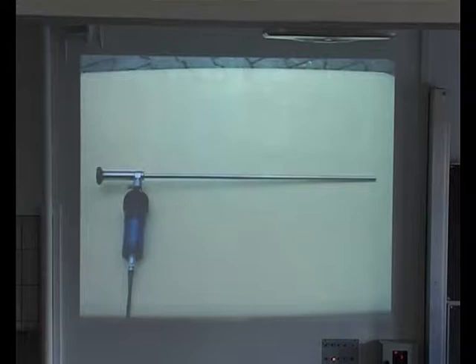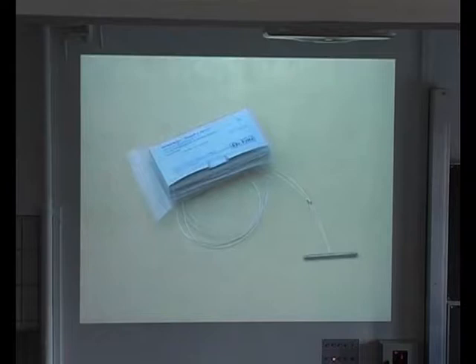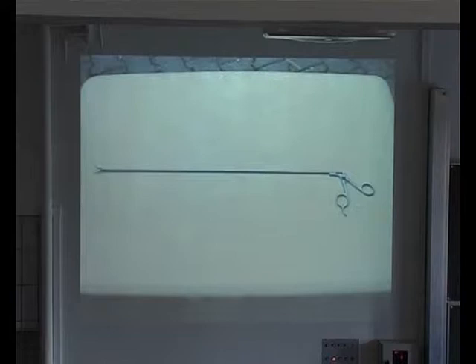We have the toggle setting trocar, and this to bring in the thread end after, and this safety toggle with a double thread, 80 centimeters long, with this mark to identify the position of the abomasum. And we have this dissector to grip the thread ends in the abdominal cavity.